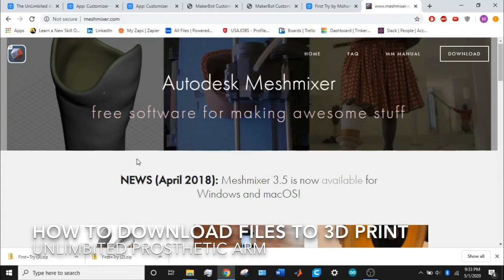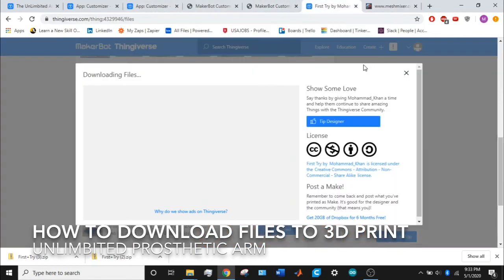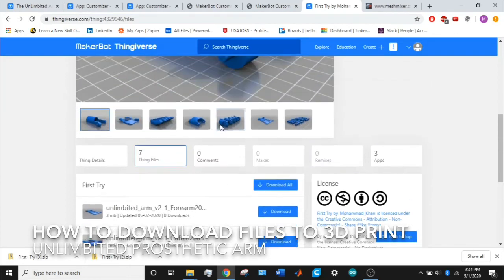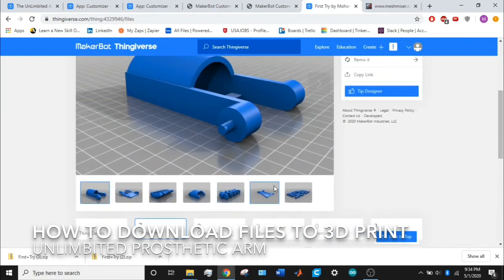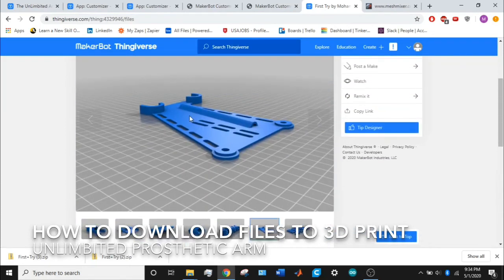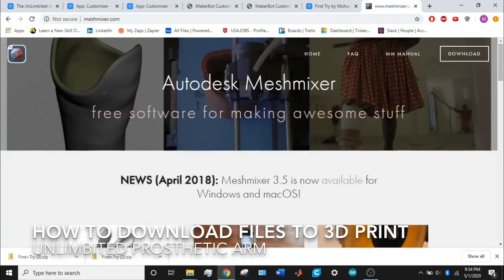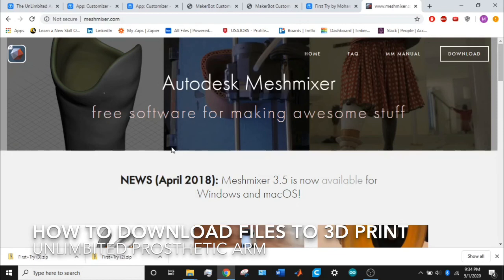It's also very handy if one of these parts—for example, this forearm part—when I was trying to print this, it was too long. So what I had to do is shorten the length a bit so that it would fit on the printing bed. What I did is I used Autodesk Meshmixer to change the size, and it fit on the printing bed and everything else was fine.